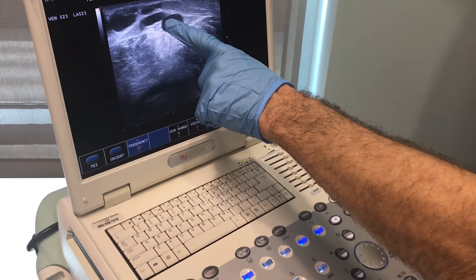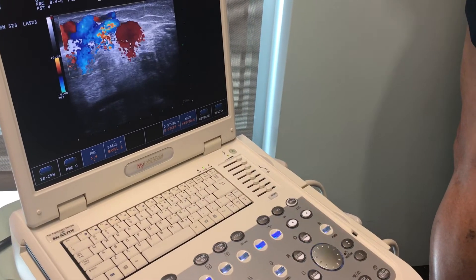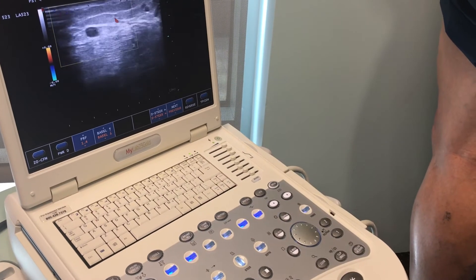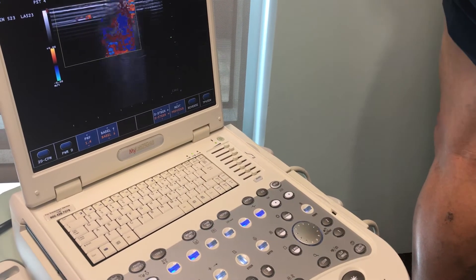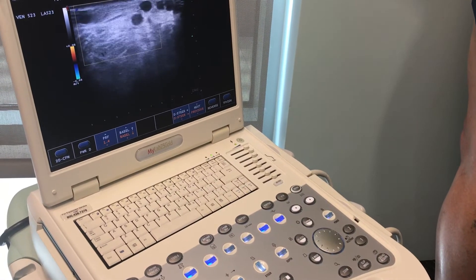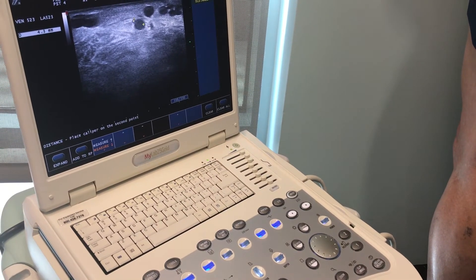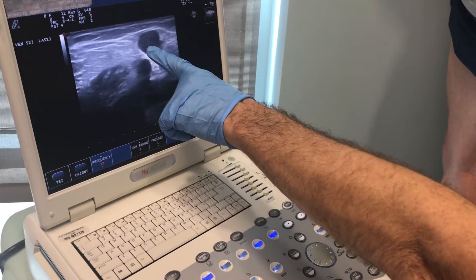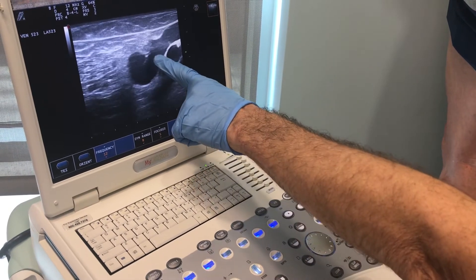Right here there's the first branch that's popping off of this vein and coming out to the lateral side of his calf. Then we have a second vein that pops off right here and is contributing to all these things. The short saphenous vein continues to reflux down the calf. What we're going to do today is actually close this vein — we're going to access it right about here because then it gets very small. We're going to take our laser up a little bit higher in this segment than we usually would and close it from right about here.